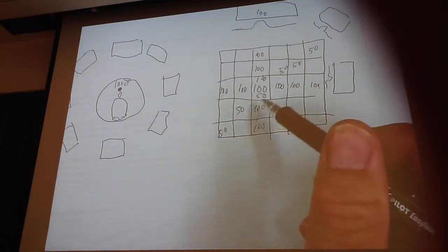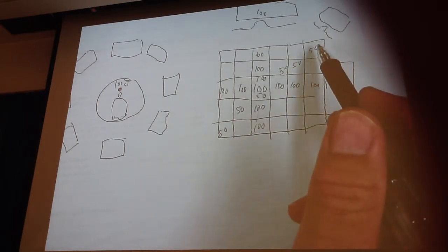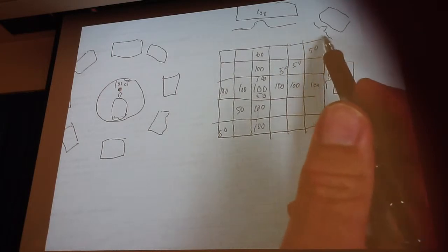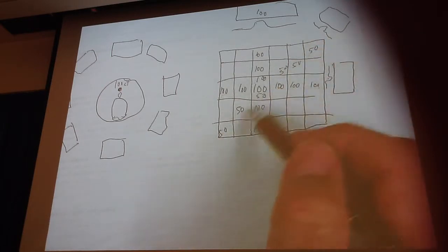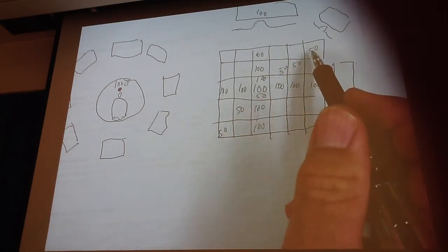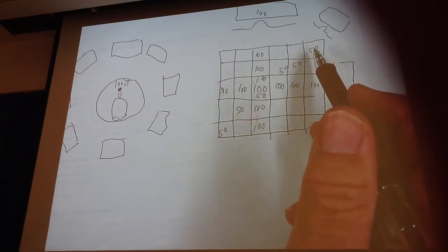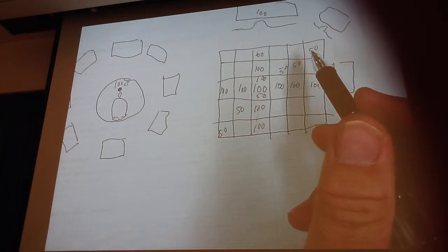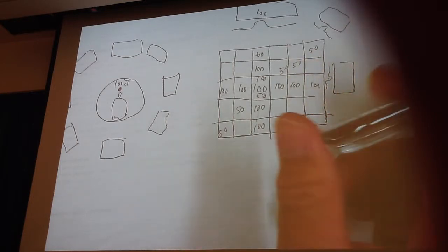Okay, so now the computer has what we call the back projection part that we're talking about. I've detected something here, I need to know its location. So by sending a signal back down there, what they call a ray path. You guys remember your geometry? What's a ray path, without looking it up on the internet? Okay, Mr. Singh, in your geometry class, what is a ray path?